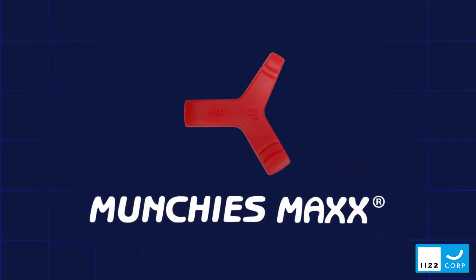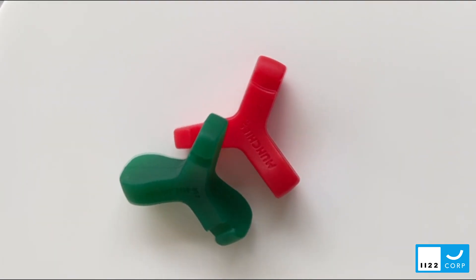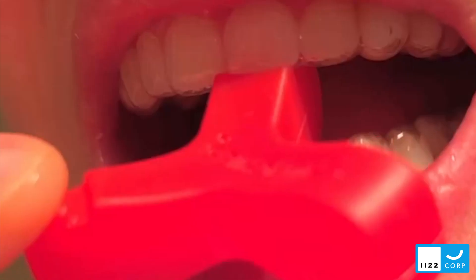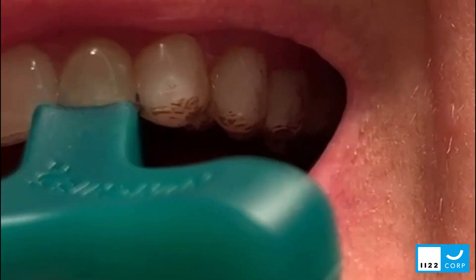The Munchies Max is 15% larger and more robust than the standard Munchies device. It is designed for patients with deeper bites or those who prefer to use it more regularly and subject the device to far greater forces.